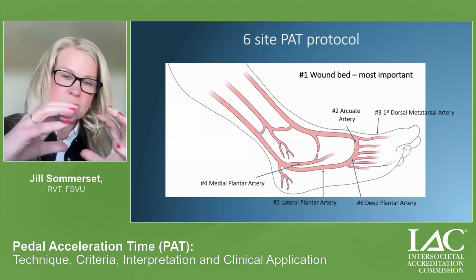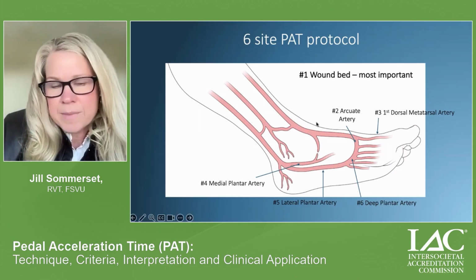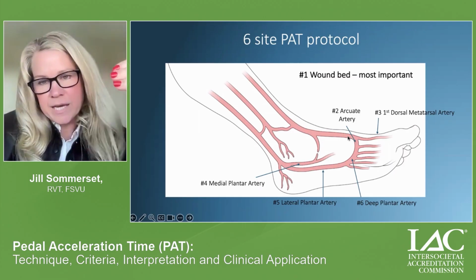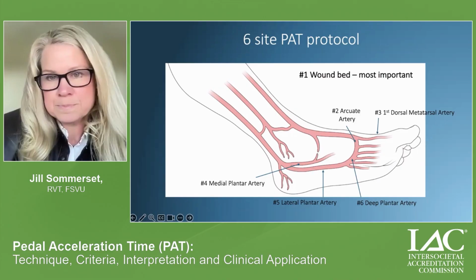So now we understand the communicating arteries, and now let's talk about PAT and the pedal arch anatomy. From the anterior circulation, we have the dorsalis pedis artery here, and it's going to bifurcate into the first dorsal metatarsal artery and the arcuate artery, which is going to dive like a waterfall.